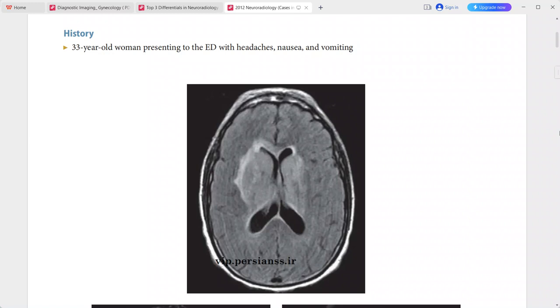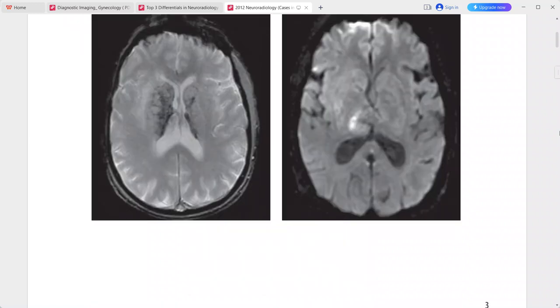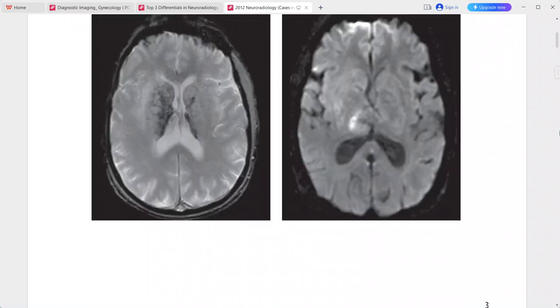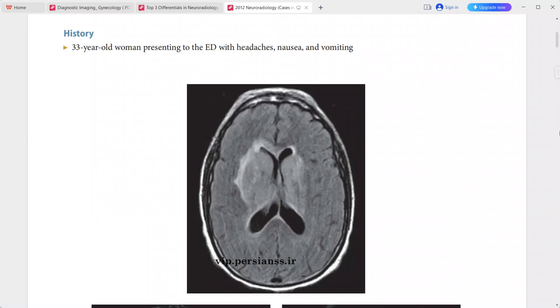Case of a 33-year-old woman presenting to the emergency department with headache, nausea, and vomiting. These are the images: the FLAIR image, the GRE sequence, and the DWI sequence. On the T2 FLAIR image, there is hyperintensity and mass effect within the deep brain nuclei and adjacent white matter.